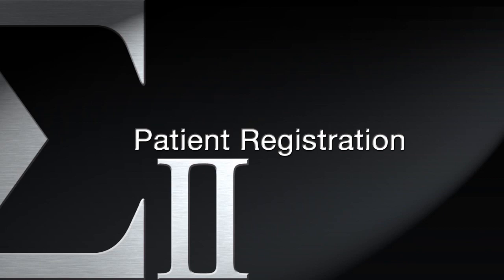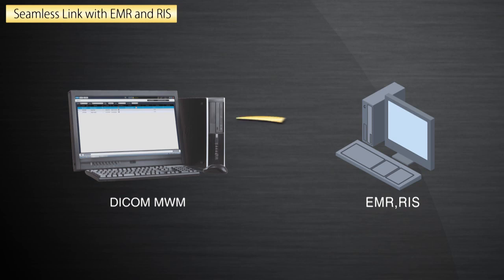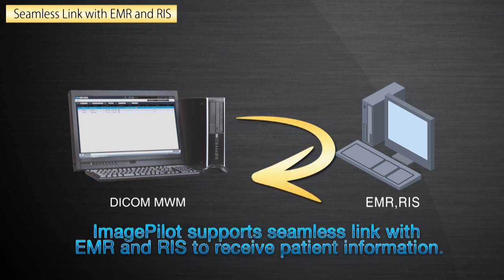Patients can be registered manually from any computer in the office or automatically. Using the DICOM Modality Worklist or HL7, patient and exam data can be accurately transferred from your EMR or RIS to the ImagePilot, thus eliminating duplicate, error-prone typing.